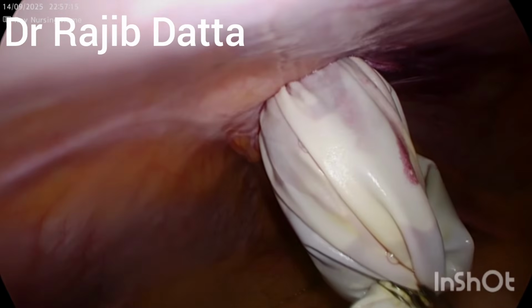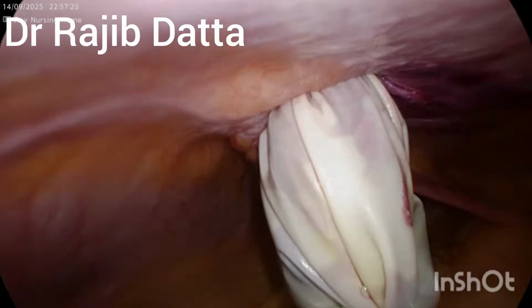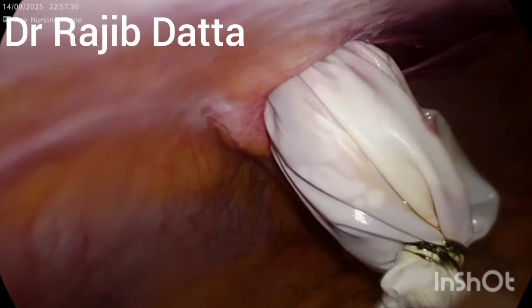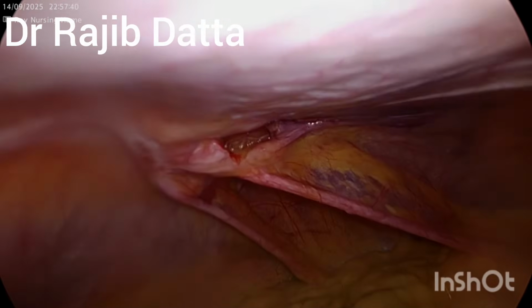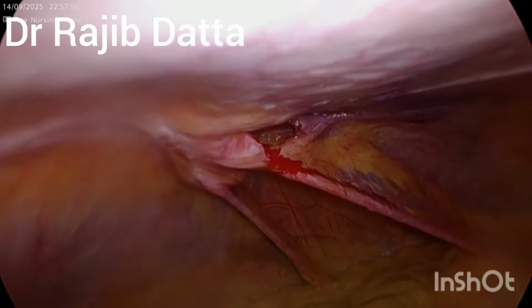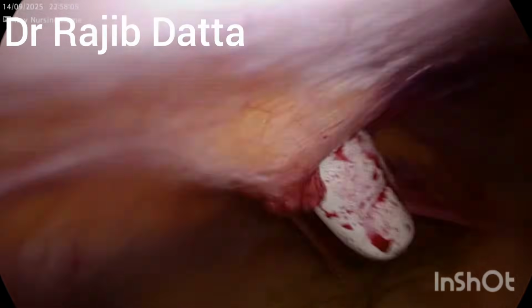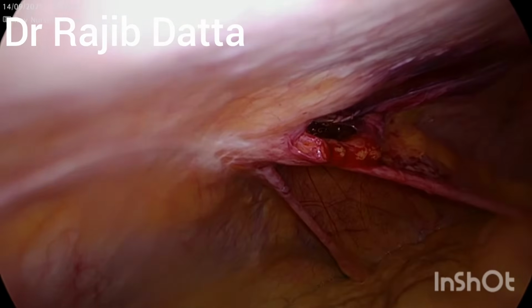And now the stones are getting stuck here. So slowly maintaining proper traction and counter traction, I am just trying to retrieve it out. So the entire specimen is out, and the umbilical port has to be properly washed out with betadine normal saline. And after that, you can see my left hand index finger to occlude the port, and proper washing of the port is needed.